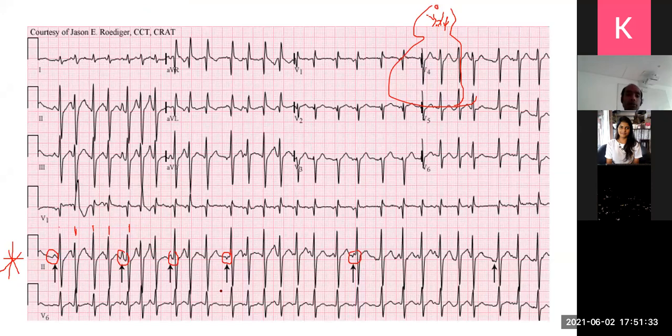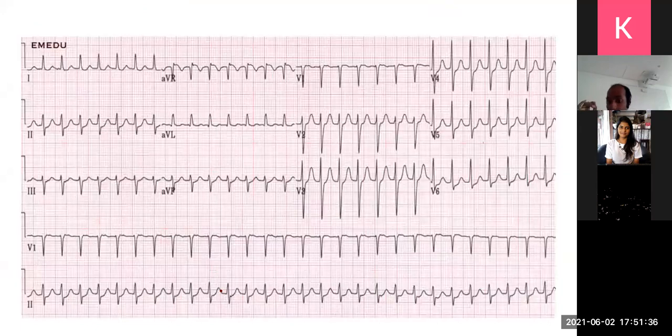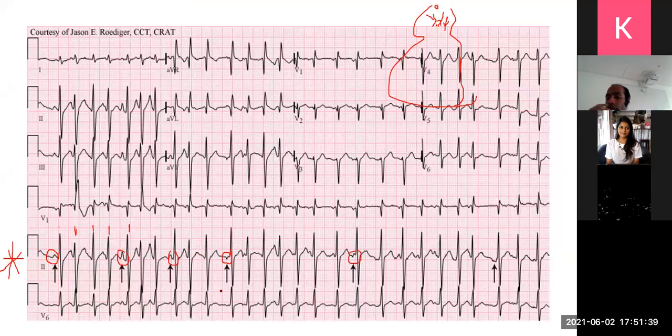Okay. Mahesh is also asking a very good question. How does a ventricular rhythm differ from a third degree heart block? In both conditions, there is atrioventricular dissociation. The difference, Mahesh, is that in a third degree heart block, it is a ventricular rhythm that you get, but a slower one, called an escape ventricular rhythm. In ventricular tachycardia, which is slightly different, you get a very fast ventricular rhythm. I'll teach this later when we talk about complete heart block. But that's a very good question. Okay.